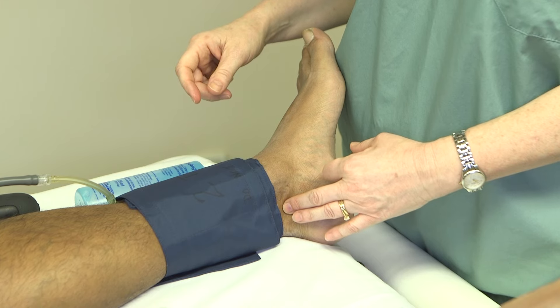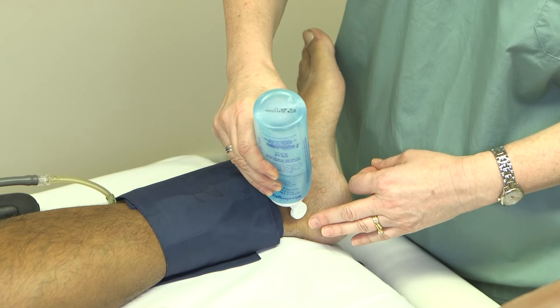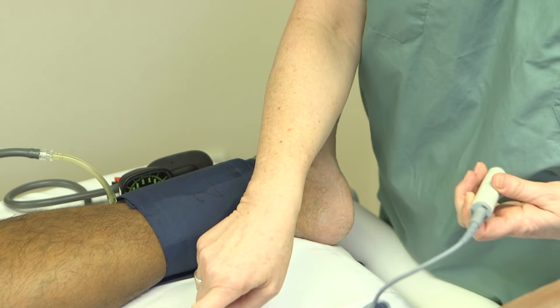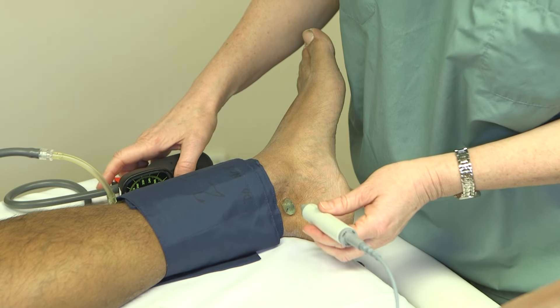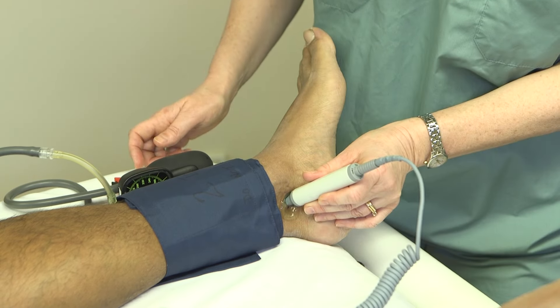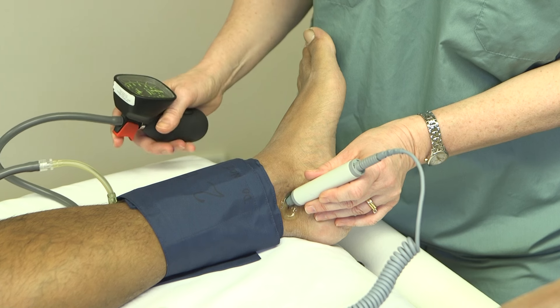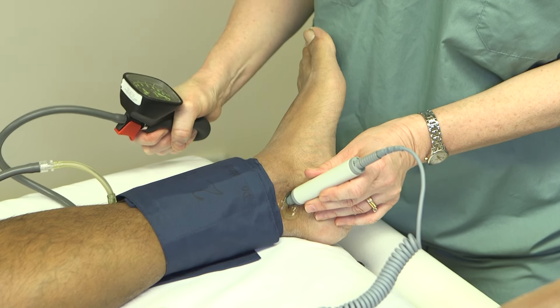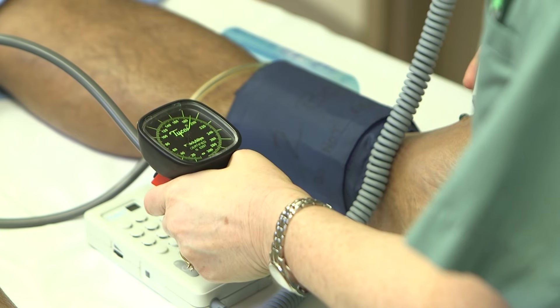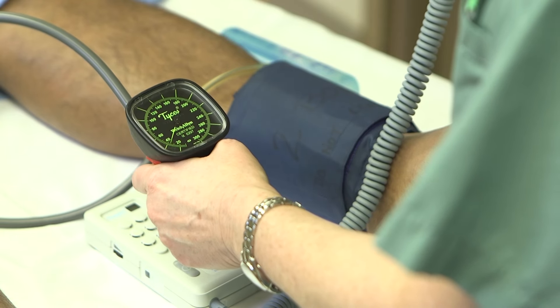Now that we've located the posterior tibial artery, we're going to apply a small amount of ultrasound gel. Using a handheld Doppler, we're going to locate the posterior tibial pulse and its signal. Now that we have located the posterior tibial signal, we're going to inflate our blood pressure cuff until we no longer can hear the signal, then gradually release the cuff until the signal returns. Again, we saw that at 100.